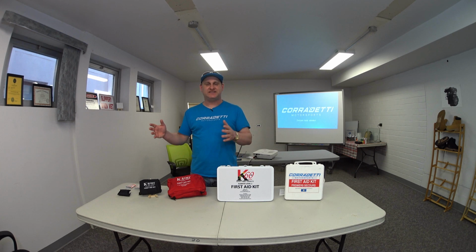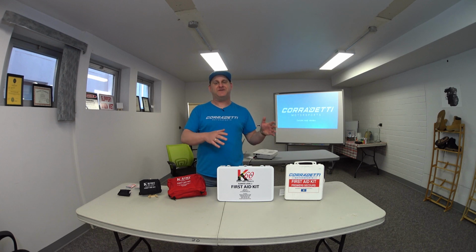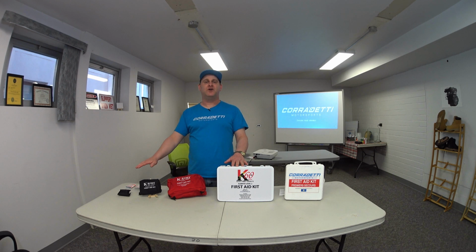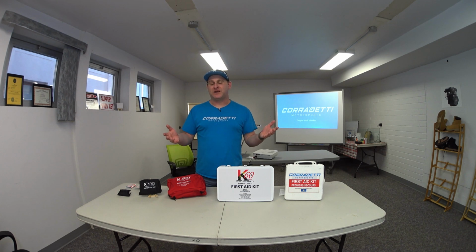What they range in is everywhere from level P to level 3. Now the level 3 is going to be your biggest party pack that contains a lot of items, not necessarily found in level 2, level 1, or your personal. So again, the ranges from P to level 3, and the legislation around that will vary depending on the type of work you're involved in. So what kit will you need?